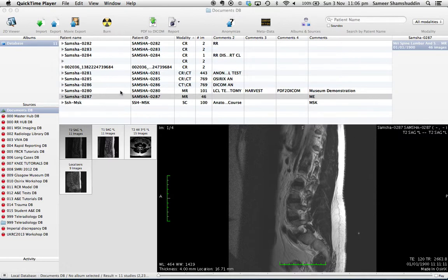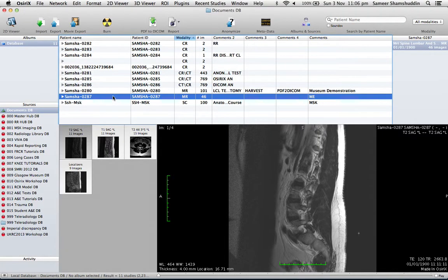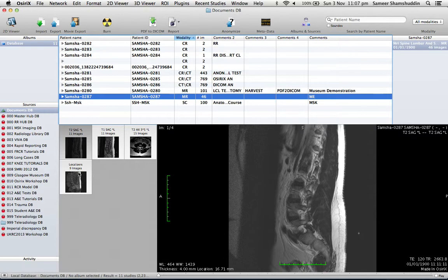So if you look at this screen, you have a database window on which I'm going to select the case. This case has got four different series: T2 sagittal, T1 sagittal, T2 axial, and a few localizers.